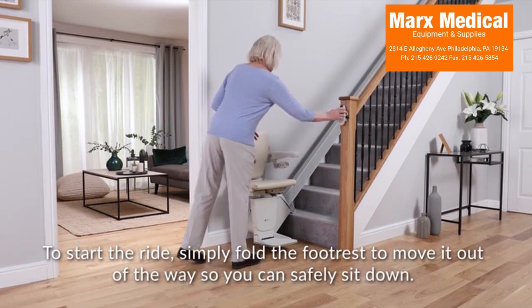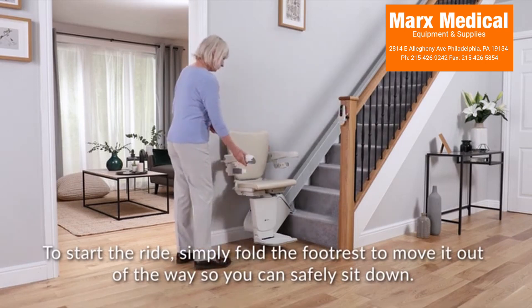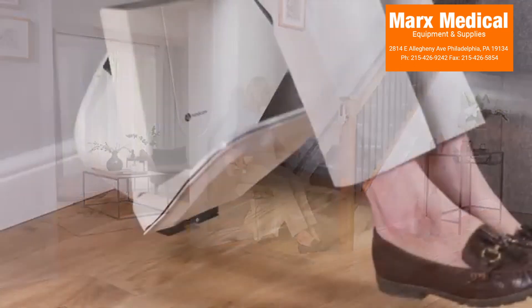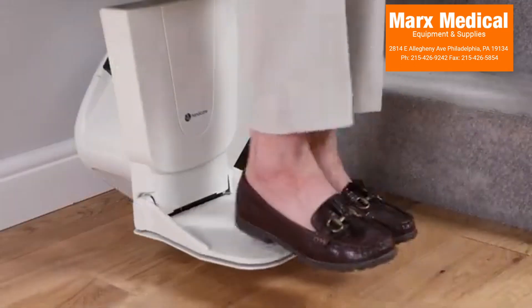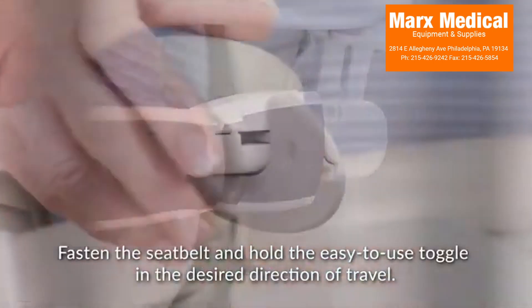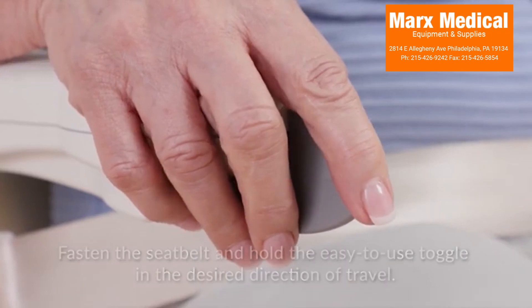To start the ride, simply fold the footrest to move it out of the way so you can safely sit down. Fasten the seatbelt and hold the easy-to-use toggle in the desired direction of travel.